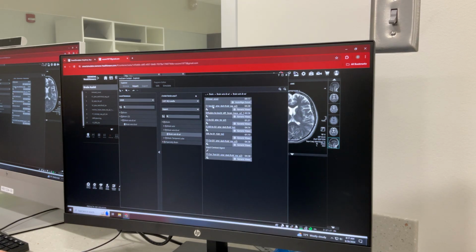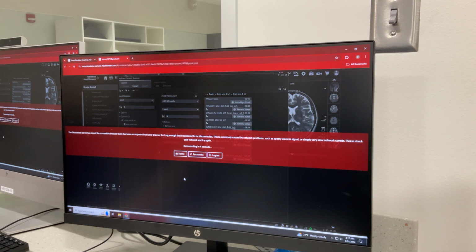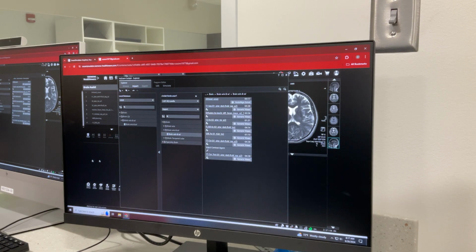How do you highlight these? Yep, so if you click on the scout and then hit your shift key. No, you have to hold it down. It's going to take, oops, I'm not sure.